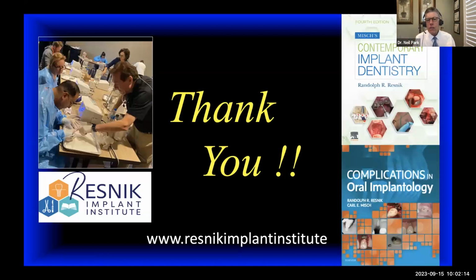So you talked a lot about the importance of hygiene in preventing peri-implant disease. Are we doing too many fixed full arch restorations as compared to overdentures that can be removed and cleaned? Well, you've been in this profession as long as I have, Neil, and you know that it's gone back and forth, at least 4 times, where fixed becomes popular, then overdentures, then back to fixed.